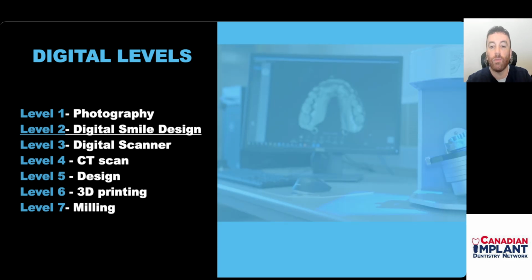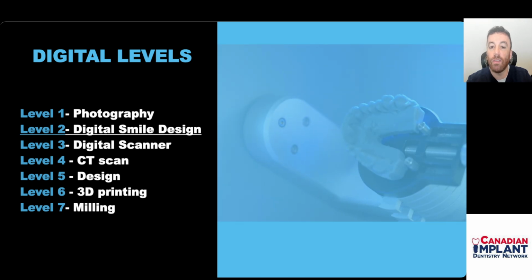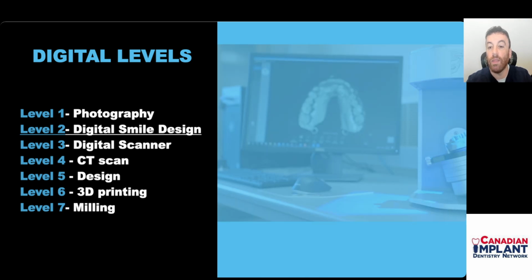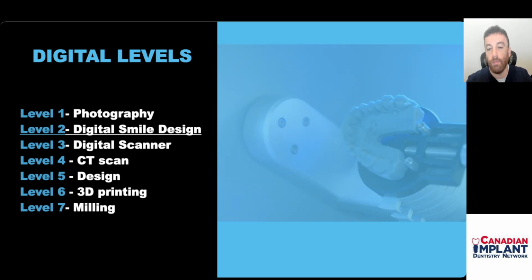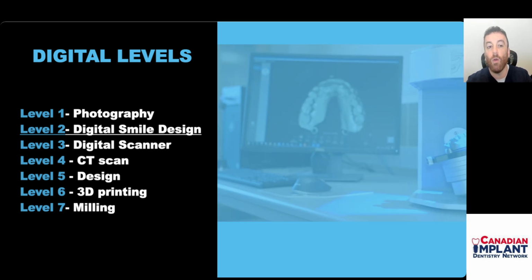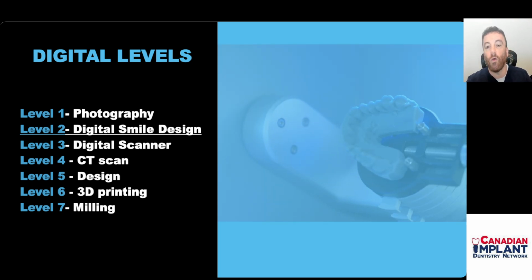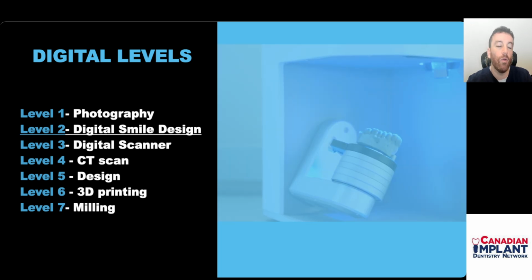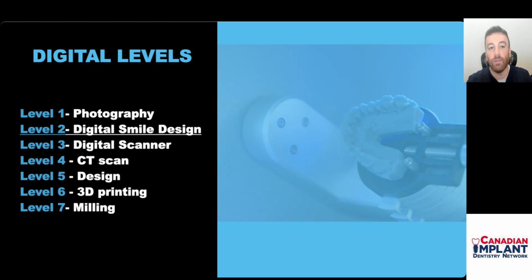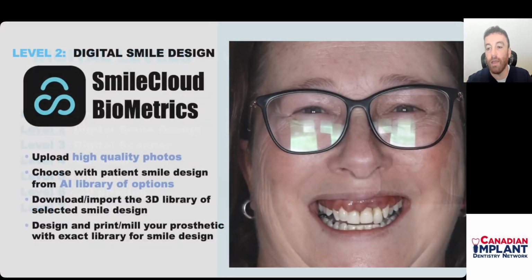This transitions all the way to level 7, which is milling, and although that is a more complex procedure, not necessarily achievable in every clinician's office, I can tell you for us, we were milling single tooth crowns for a number of years before we transitioned to implants. But understanding where you are on the spectrum of digital levels helps you to understand your workflow process and eventually potentially your end goal as somebody who is involved further in digital dentistry. So depending on which level you're at, it's important to understand that.